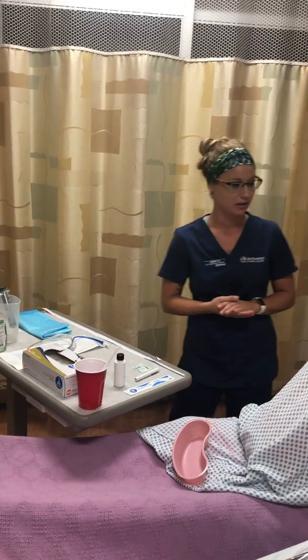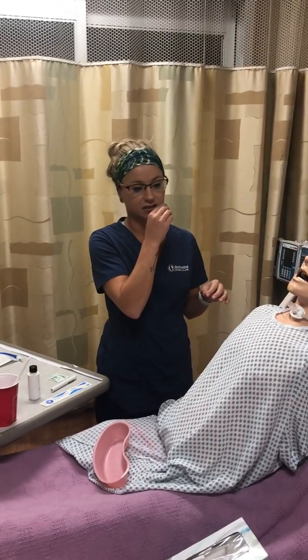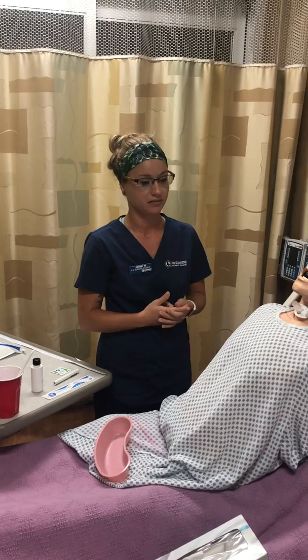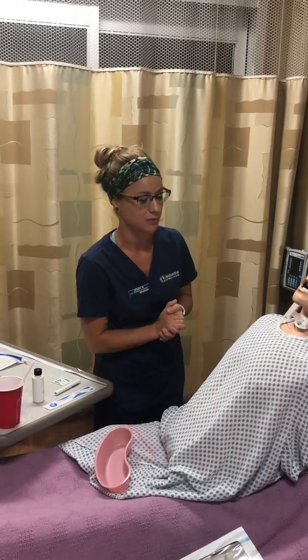So before inserting that, if my patient was on oxygen, I would make sure for the procedure I would either put the nasal cannula in the alternate nostril, so they're still getting enough oxygen. I would have a continuous pulse oximetry probe on so I can monitor throughout the procedure, or a simple mask might be helpful as well.